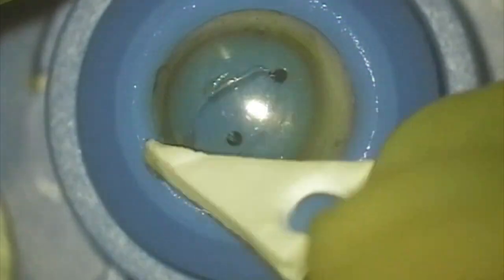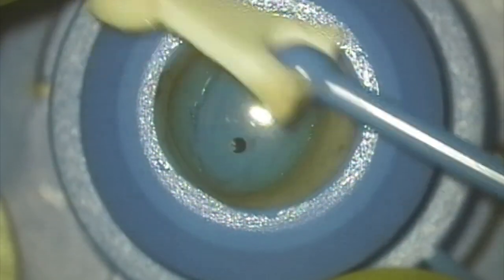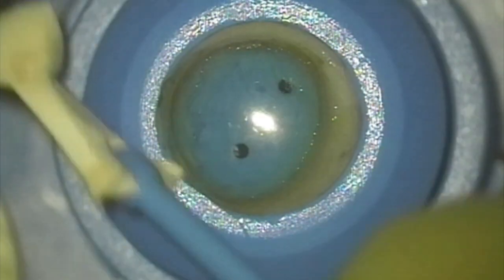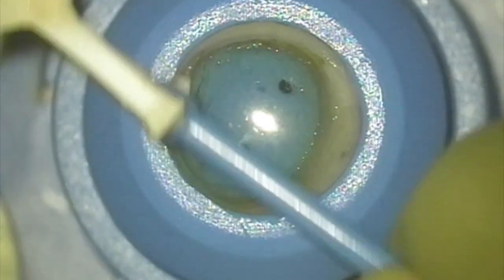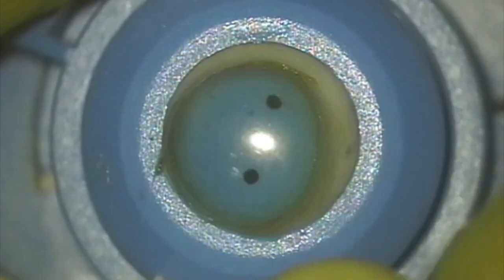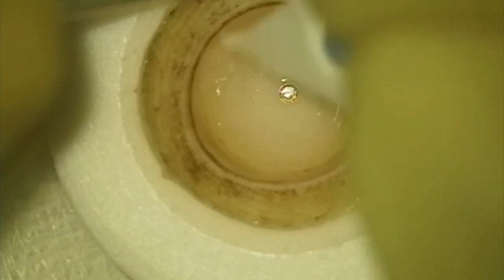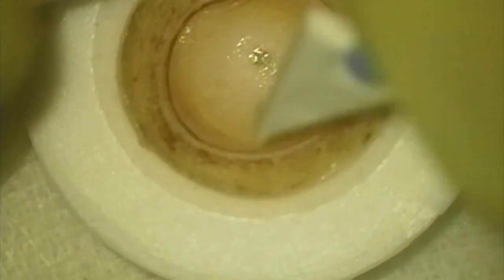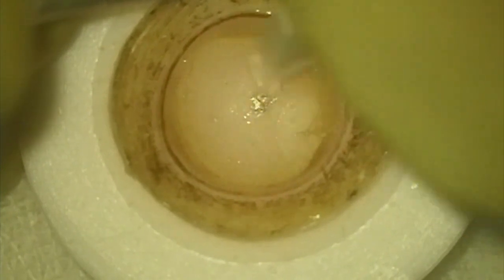I'd like to reiterate that though I have used a donor corneal scleral rim here, this could also be prepared using any source of allogenic tissue, such as processed packaged or any other kind of allogenic tissue. You can see me here using a donor corneal scleral rim, and I have removed the epithelium completely, then removed the rim from the artificial anterior chamber, and also removed the endothelium completely.